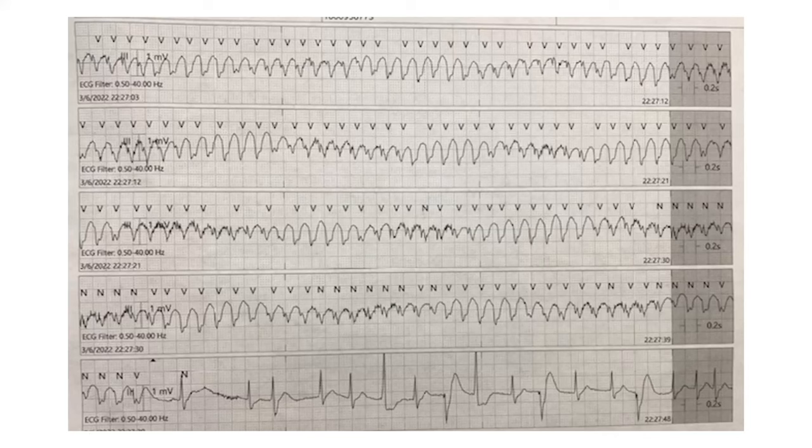You see, aberration will not stop like that. If it was AFib with RVR with aberrant conduction, it would gradually slow down. It will not suddenly switch morphology. Yeah, and it stops.